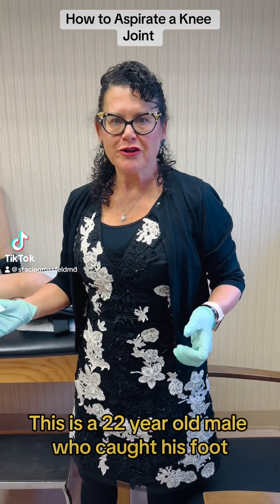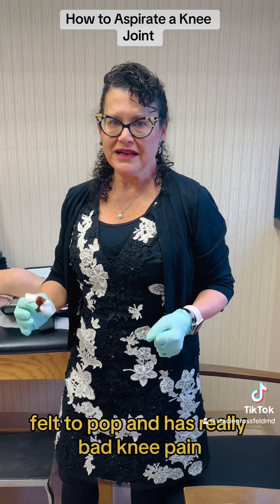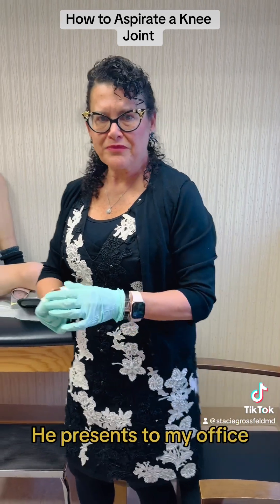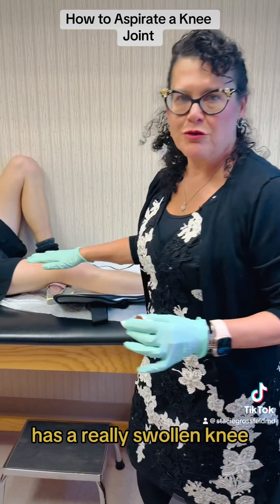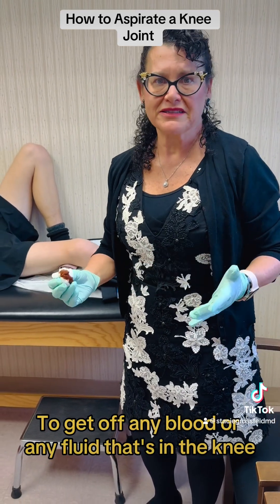This is a 22-year-old male who caught his foot, twisted his ankle, felt a pop, and has really bad knee pain. He presents to my office with a really swollen knee. I'm going to go ahead and aspirate the knee to get off any blood or fluid that's in the knee.